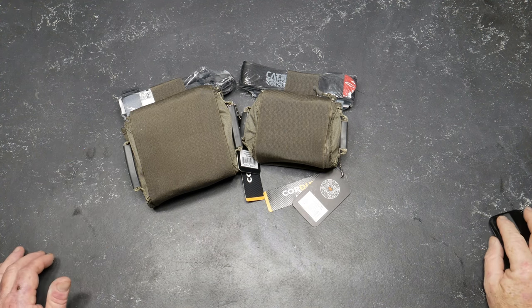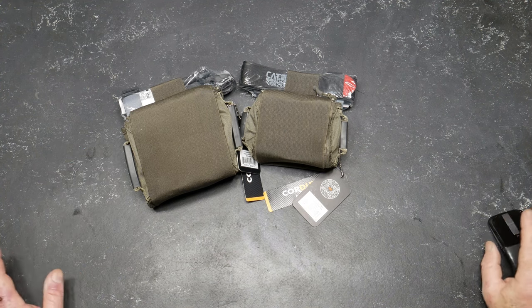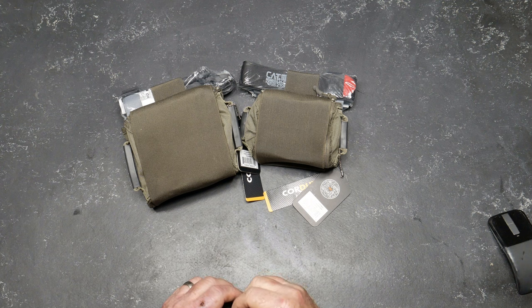All right, guys, KB32 here. Check it out. We're sitting over here on the review table. It's been a while since I've done a review — it might be a little rusty — but we're going to knock the dust off and try to do what we can.